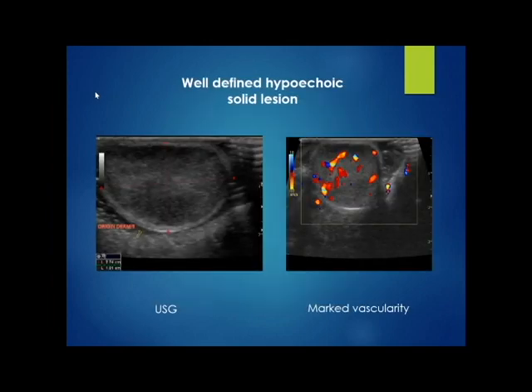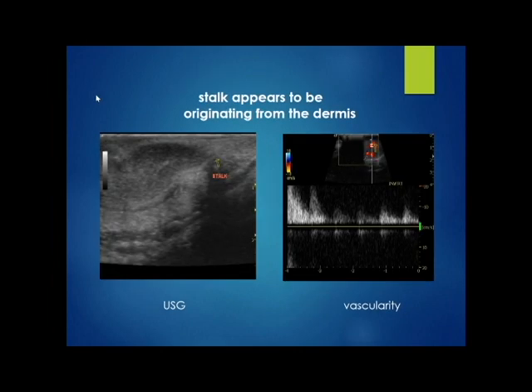Here are the key images of the case. On gross examination, the lesion is visible as a pedunculated mass on the back region. On ultrasound, we can see a well-defined solid hypoechoic lesion which shows marked vascularity. The stalk of the lesion appears to be originating from the dermis layer.